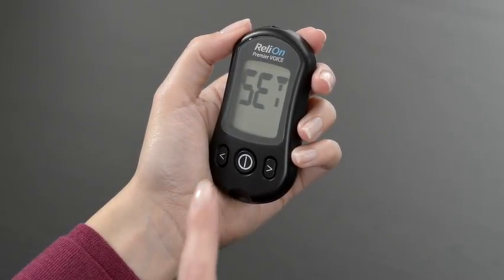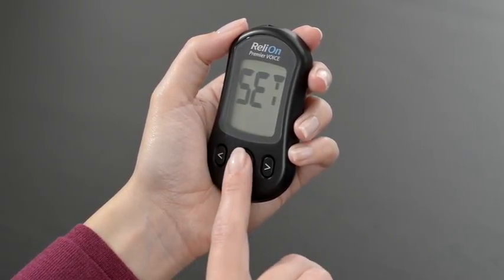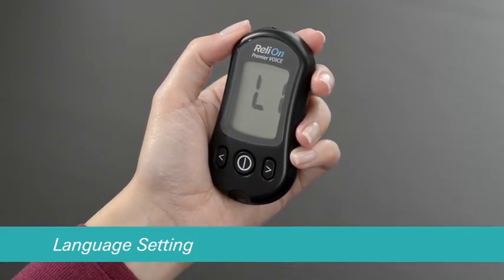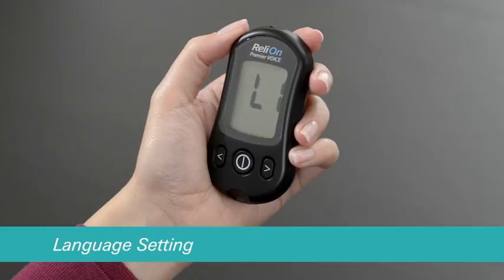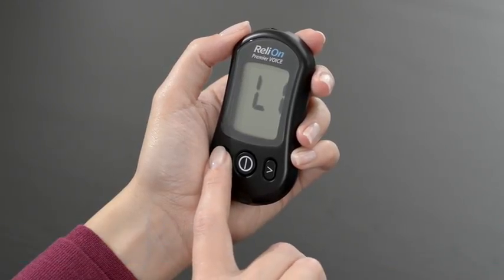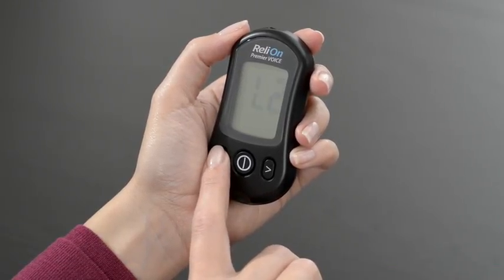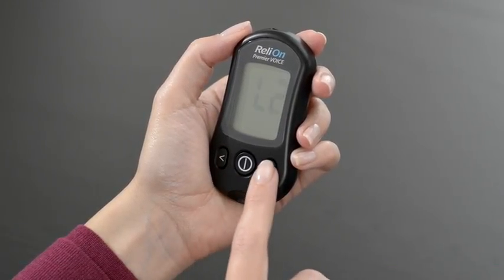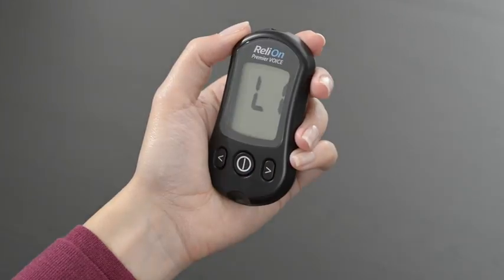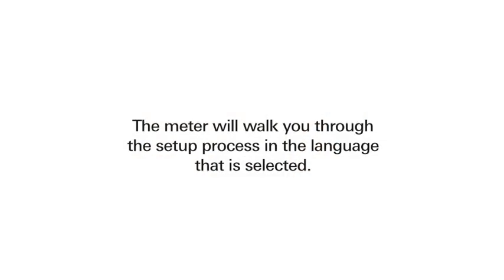Press the center button again to enter the language setting. Use the left or right arrow buttons to select L2 for Spanish or L1 for English. The meter will walk you through the setup process in the language that is selected.